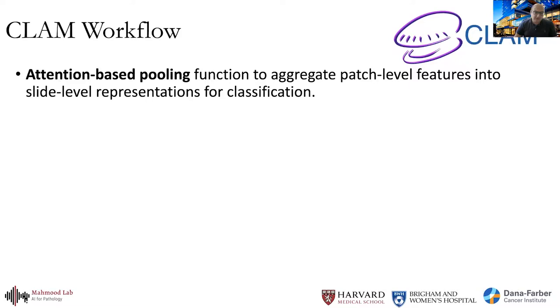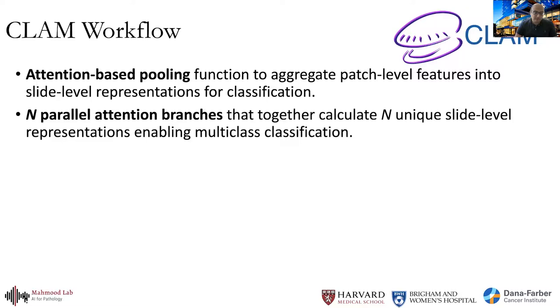We call it CLAM. It uses some bells and whistles, which I'll briefly talk about. So it uses attention-based aggregation. When we have a whole slide image, it learns what region of the whole slide is most important on its own. It has n parallel attention branches, which means that you can begin to solve multi-class problems.